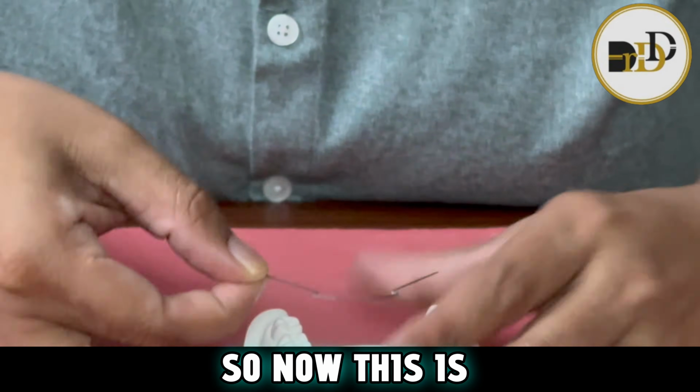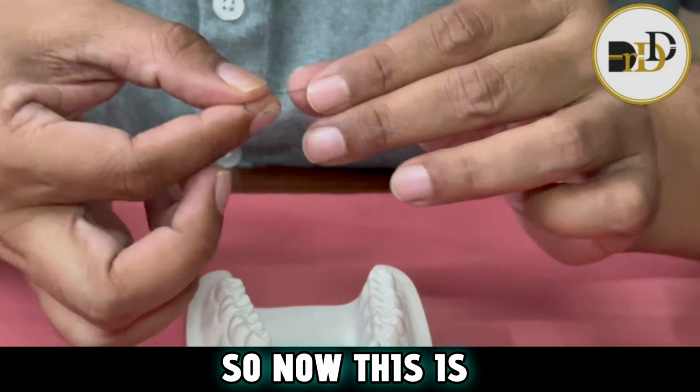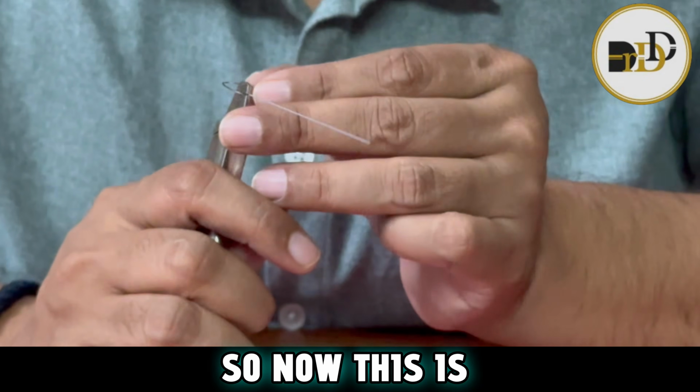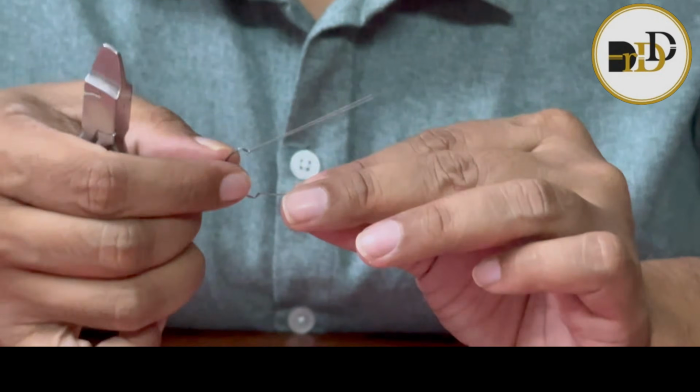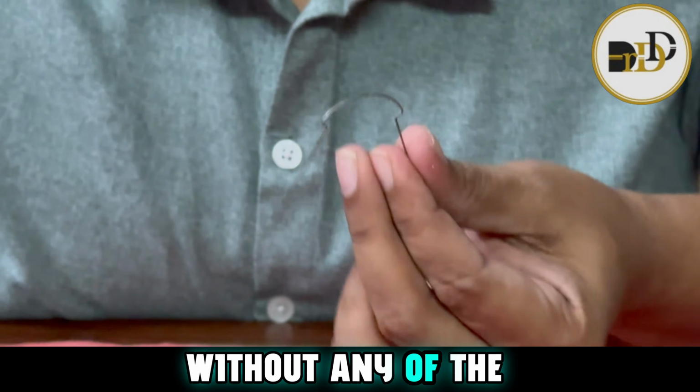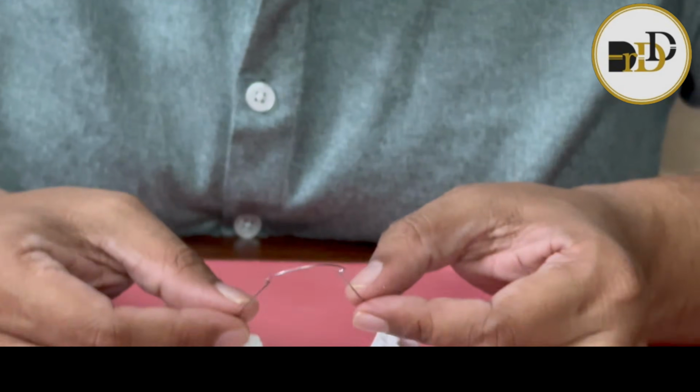Now this is the lingual form after fabrication, without any compensations.